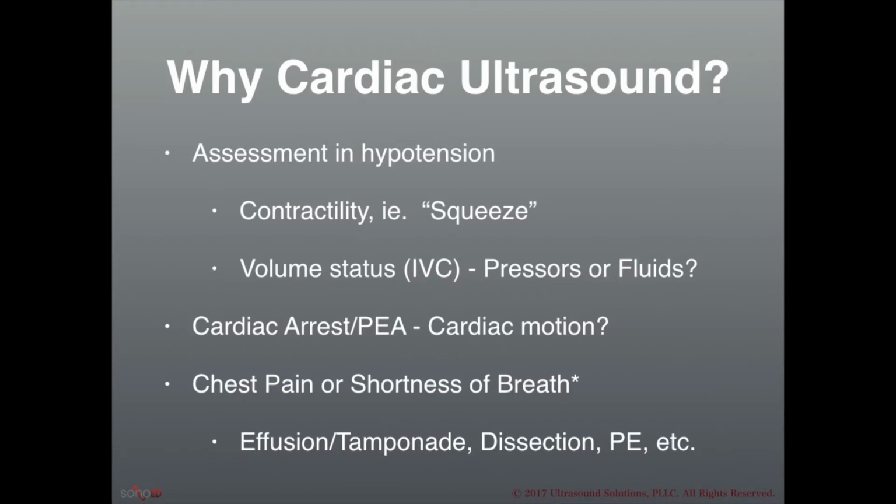Although, as you'll see listed here, for pericardial effusion and tamponade ultrasound is the gold standard, but for some other diagnoses like dissection of the aorta or pulmonary embolus, it can augment the workup, but we can't really use it to rule those conditions out. More on that to come, but just be aware these are the scenarios in which we would want to use point of care cardiac ultrasound.